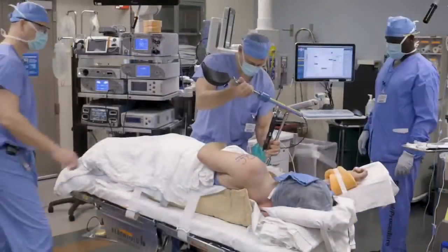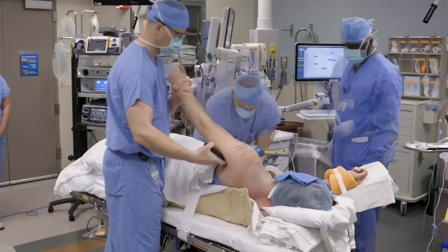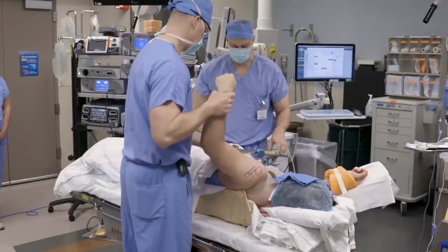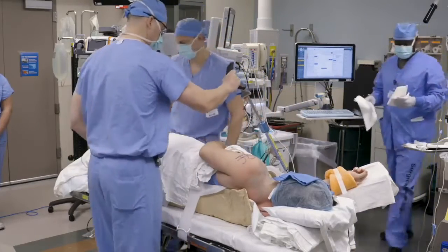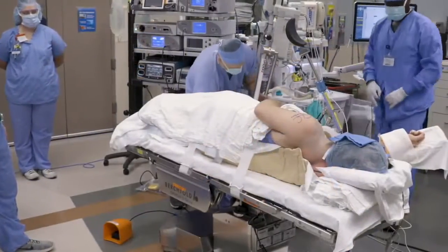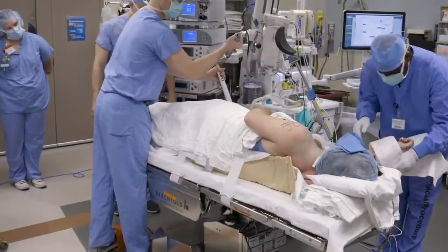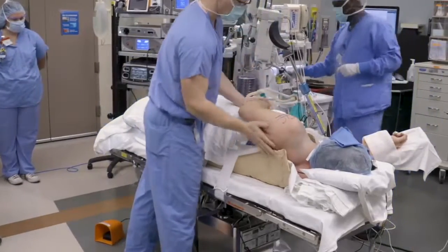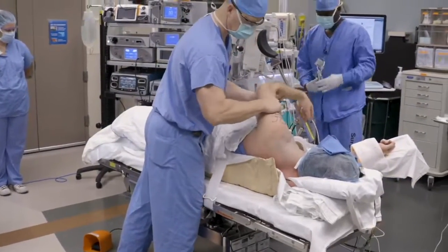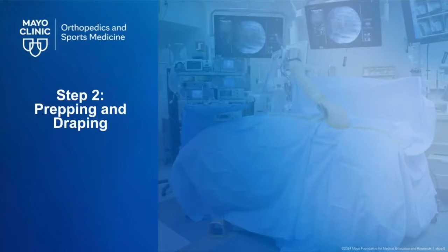An arm bolster is placed on the opposite side of the table and then positioned appropriately. Once it is secured, it can be moved out of the way to allow for appropriate draping. A mechanical arm holder will be used to apply traction throughout the case. This is positioned on the opposite corner of the bed. The patient is typically positioned with a posterior tilt of about 20 to 30 degrees so that the arm becomes vertical when traction is applied. An exam under anesthesia is then performed. We are then ready to proceed with prepping and draping.